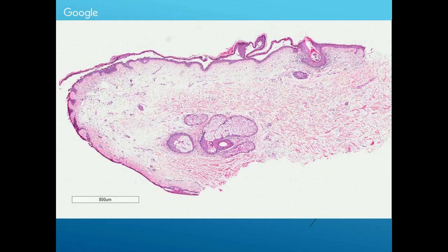So if it is a subcorneal split, so this is the subcorneal split actually. So once you have decided it's a subcorneal split, your list of differential diagnosis is what now? Pemphigus foliaceus, staphylococcal scalded skin syndrome, bullous impetigo. That's it basically. Those are the 3 things that you're going to think of. Am I dealing with bullous impetigo? Am I dealing with a staphylococcal scalded skin syndrome? Or am I dealing with pemphigus foliaceus? So now, how do you differentiate between these 3 conditions?